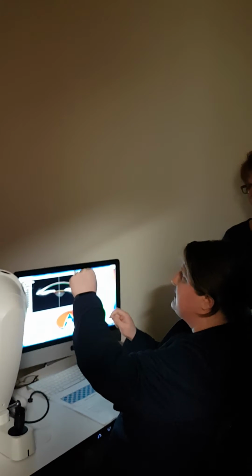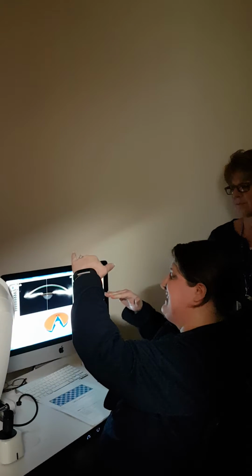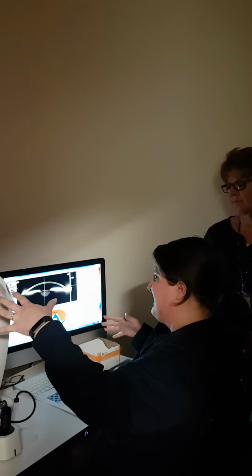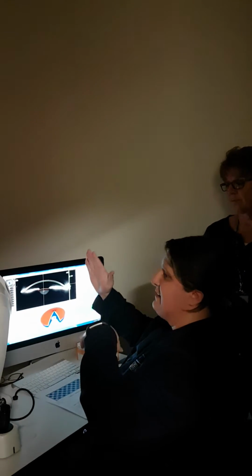He's going to remove sutures from whichever area is the steepest, so that it flattens it out. If that makes any sense. So it'll be the red.